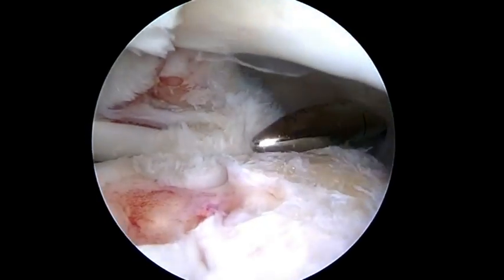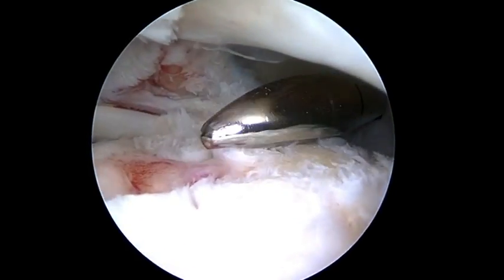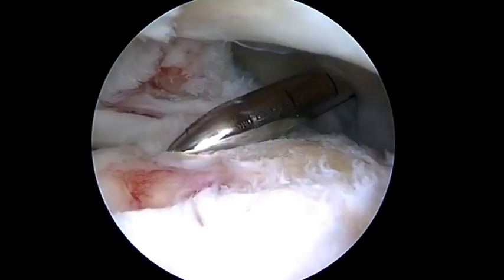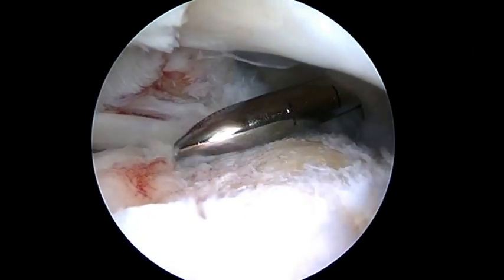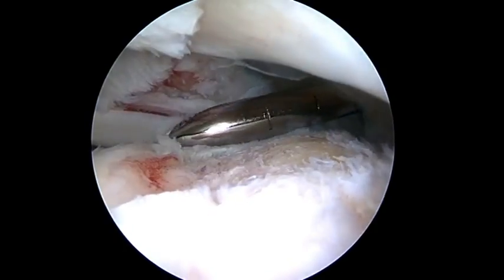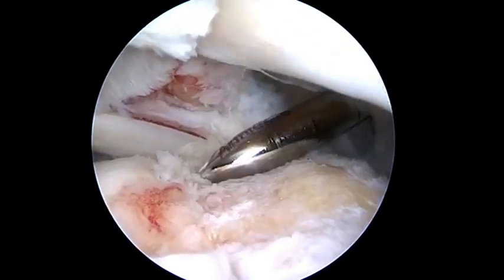It cleans the soft tissue back to a nice bleeding bed, but it really doesn't take too much. The tip allows you to get into the greater tuberosity's articular margin without disturbing it. You can also go over by the biceps and not worry about engaging that.